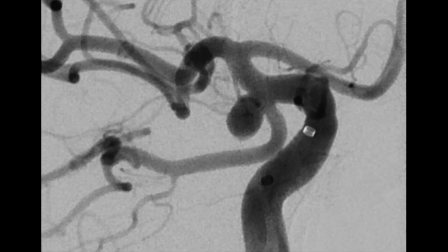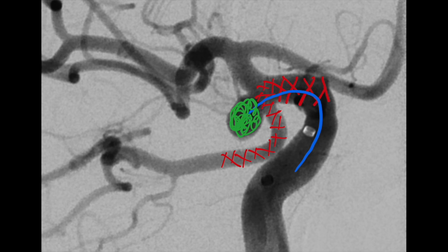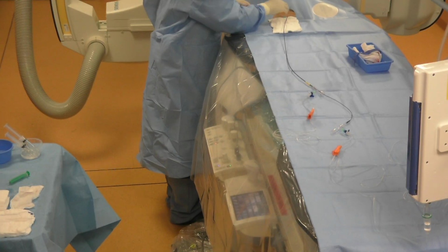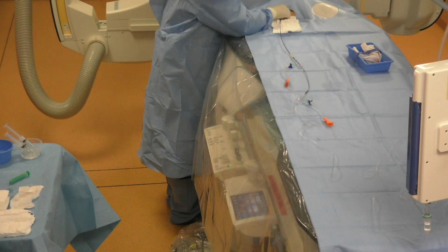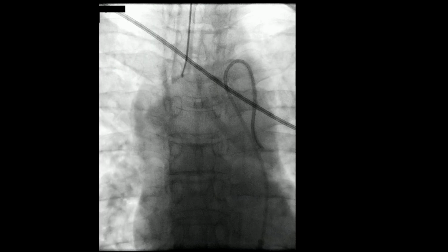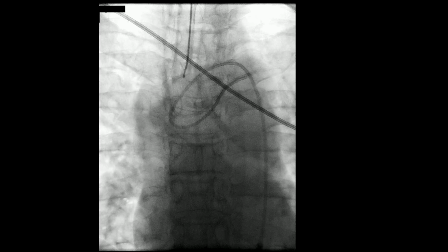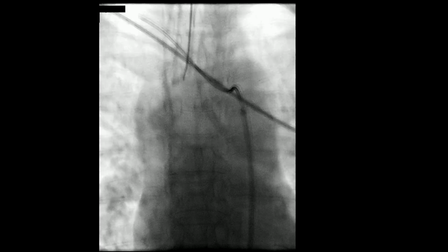And here is the 2D angiogram, and the plan is to implant the microstent as mentioned and go with the microcatheter through the stent struts and coil the aneurysm sac. And here we go. We push the long sheath Neuron Max with the select catheter in the short femoral sheath. Configuring the Sidewinder catheter is easy, and here we're navigating the right common carotid artery.